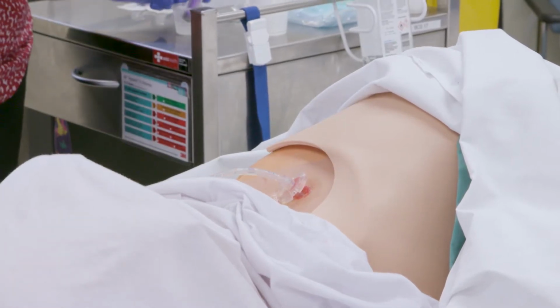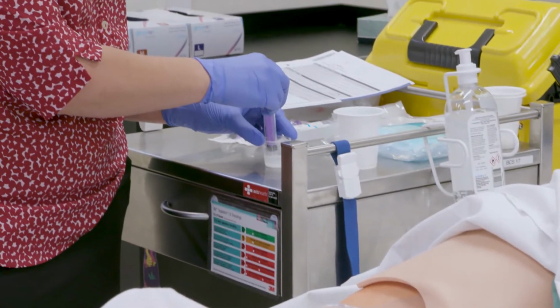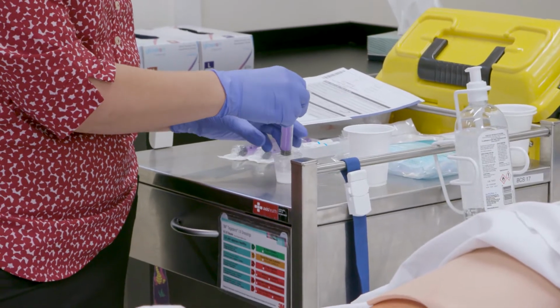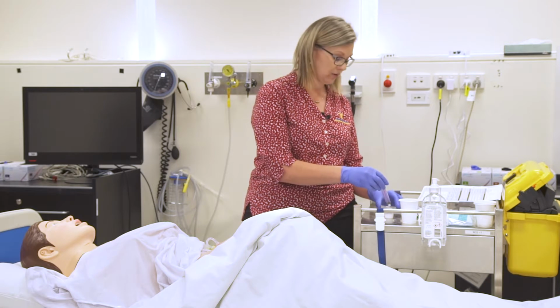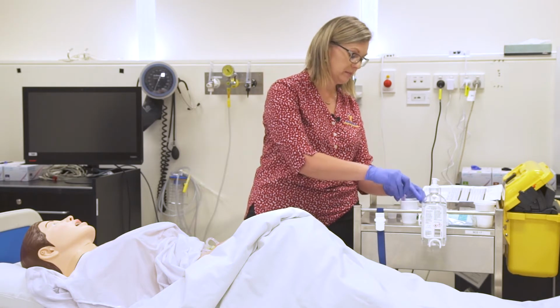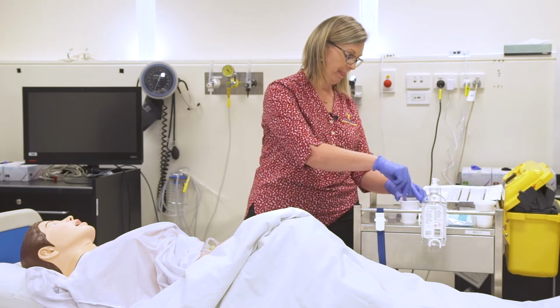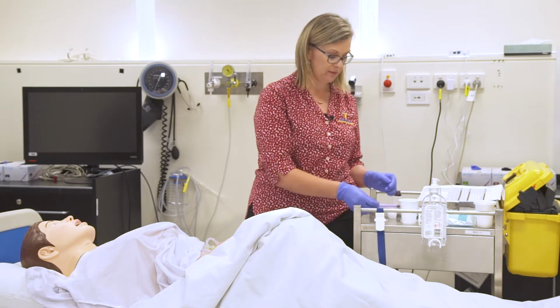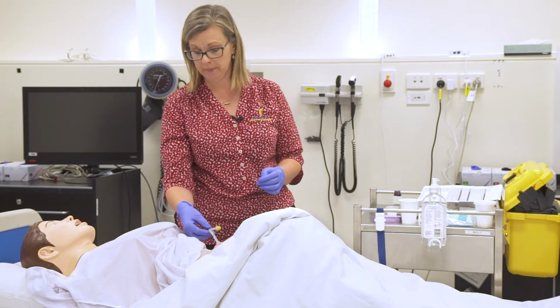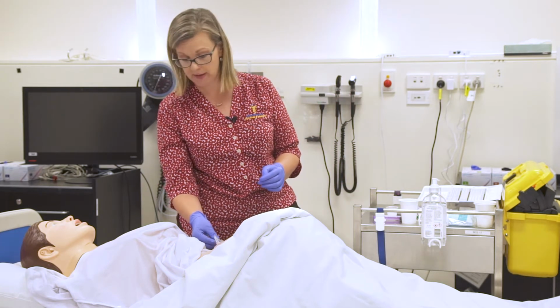When you crush your medications, it's important to make sure that your medications are able to be crushed within the drug guidelines. Panadol, Mary, is okay to be crushed, so we'll dilute that with 10 mils of water. And we want to make sure that that dilutes properly. If we don't, we run the risk of blocking our tube. Okay, we don't want that to happen, do we, Mary?